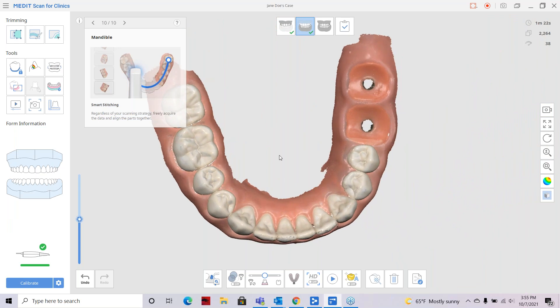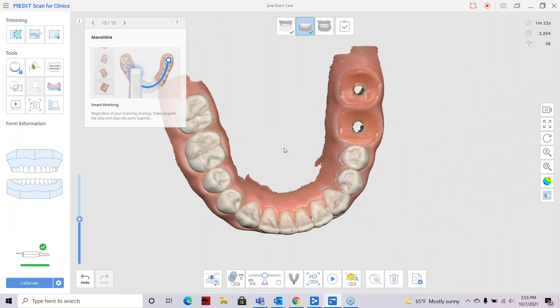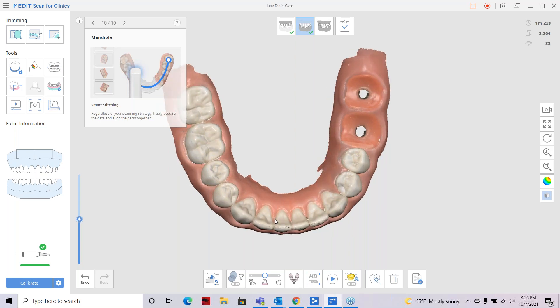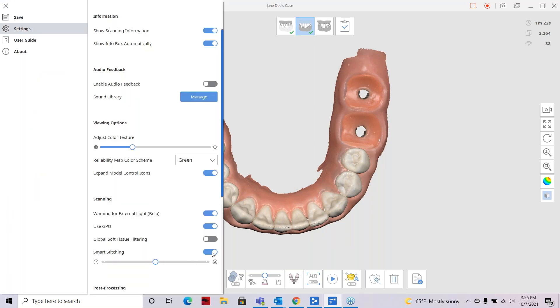I've got some interproximals to get. When I'm working with people who are initially starting to scan, I like to get them doing the basic scan path. It's really vital that to prevent distortion you zigzag across the incisal edge to get accurate information. When you come back to scan the labial or lingual surface, it's easy to add that information once the incisal edge has been established. You can switch smart stitching on or off by going to Menu, then Settings.